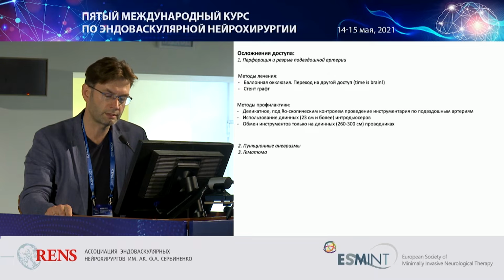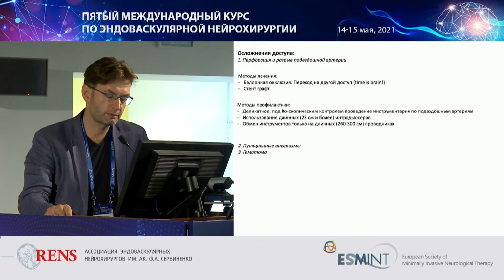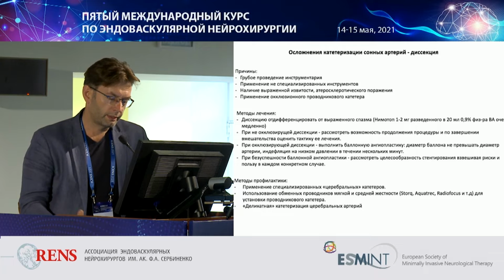Once the bleeding has stopped, you'd better shift to an alternative approach and perform mechanical thrombectomy from the cerebral arteries. And when the blood flow is restored, you can come back to the iliac arteries and reimplant a stent graft.